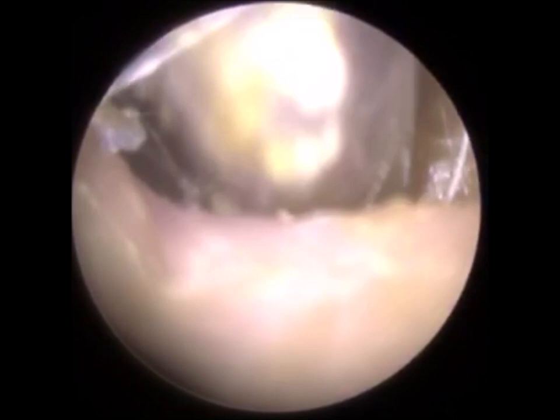But again, I'm sorry for the blackout. It's just I forgot to edit this bit. It was a long video. I'm just scrolling downwards, and that should be the last bit that I forgot to edit, and I do apologize. But yeah, forceps, again, it's not as simple as just putting some forceps in the ear, gripping something and pulling it. There's resistance there.